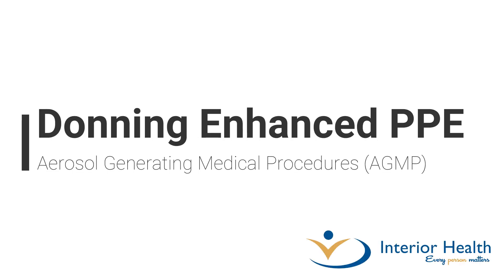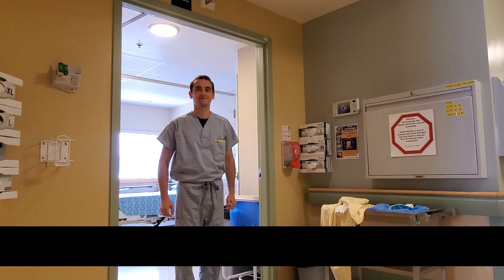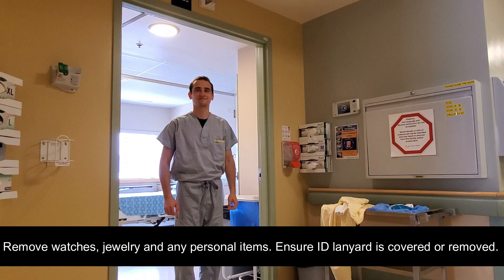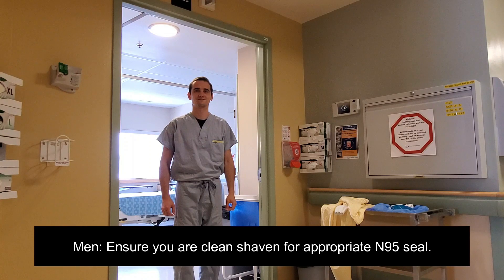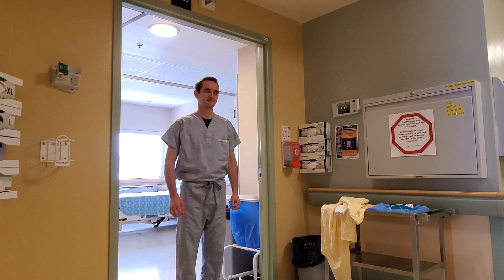Donning enhanced personal protective equipment for aerosol generating medical procedures. Start by removing any jewelry, watches, and any personal items. Ensure ID lanyard is covered or removed. Secure hair back. Ensure facial hair is clean shaven for an appropriate N95 seal.